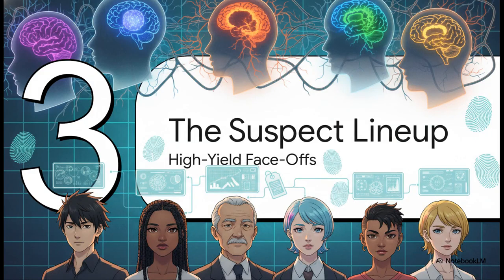All right, detective, we've gathered our initial clues. Now it is time for the suspect lineup. We're going to use what we know about location and the patient's age to put the most common tumors in a head-to-head face-off and see who matches the evidence. This is where the patterns really start to jump out at you.